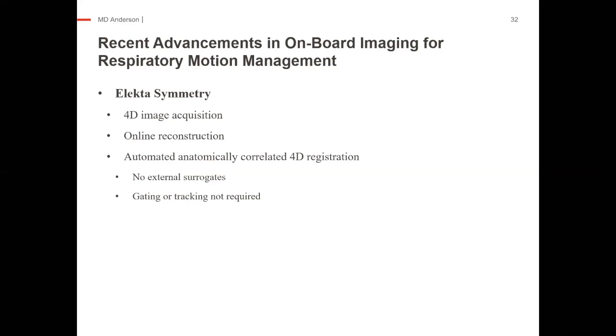And another question, how do you handle lesions that are close to the hepatic portal vein? So that's a good question. With the portal vein, you don't want to have circumferential radiation of it, right? So you're going to put just a limiting structure there to limit the dose. And there's typically going to be like a 5 millimeter to 1 cm margin, we create a PRV or planning risk volume. And so basically just limit the dose to that PRV.